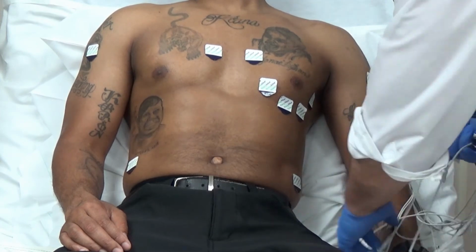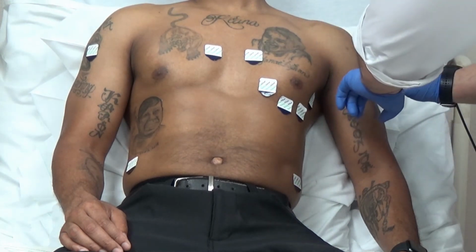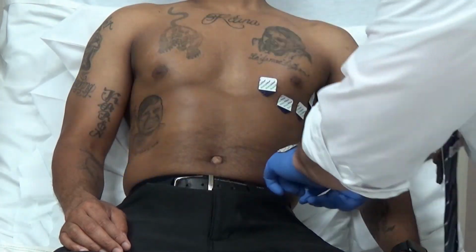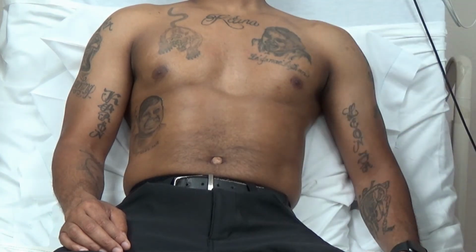Okay, so now the part where we have to take the stickers off the patient. Typically what I'll do is say, sir, I'm going to be pulling these stickers off, and I'll rip them off as quick as possible. Usually I just hold them to the back of my glove. Okay, and then we're done.